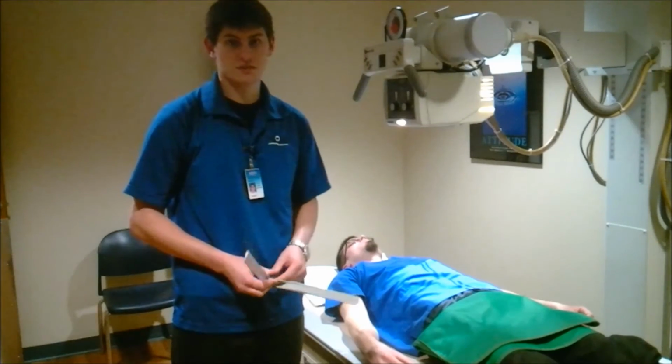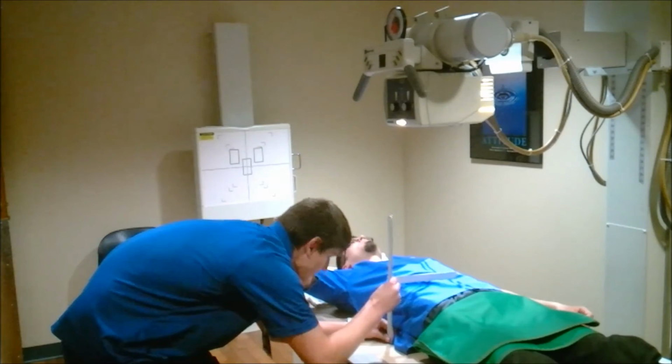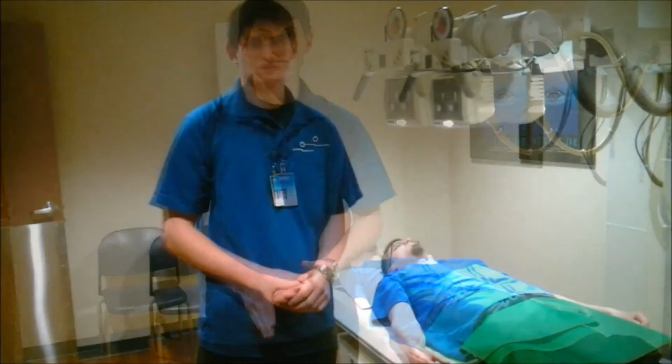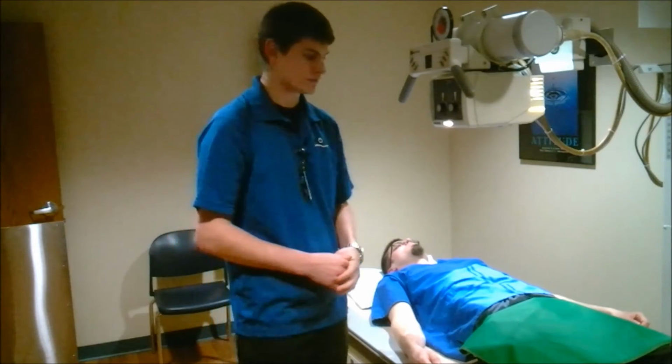We want to measure, so move your hand there, sir, please. Thank you. When he measures 20 centimeters, include in our exposure factors, large focal spot, to ensure that we have all of the anatomy on the x-ray.